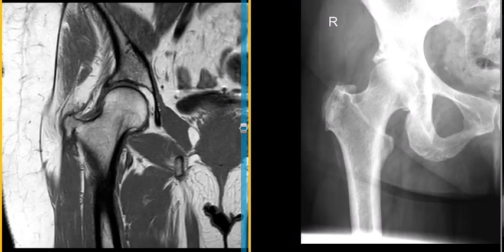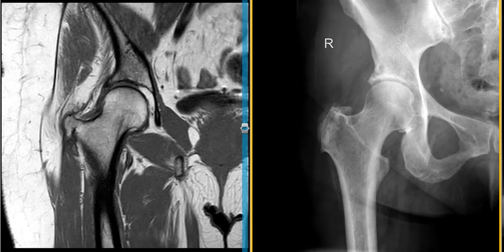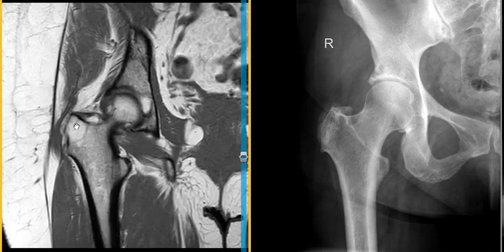Hello, this is Dr. Gay from First Lick MRI. This is a 61-year-old female with complaints of chronic right hip pain. We have an x-ray of her right hip and an MRI, a T1-weighted view of the right hip, to show you the findings on two different imaging modalities.